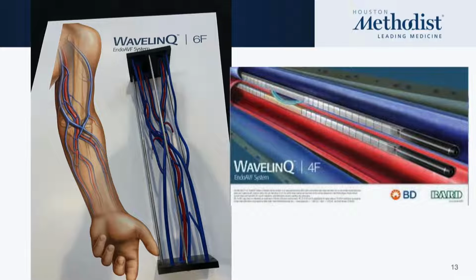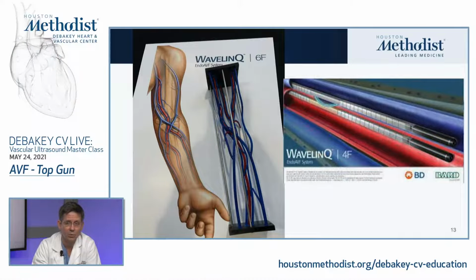And this really needs for the perforator to be intact, because you're going transvenous as well. We need to know about the size and quality of the deep veins, which previously was not important in mapping, but now is. So for this mapping protocol, you need to know about the size of the ulnar vein and radial vein near the wrist and near the antecubital region.